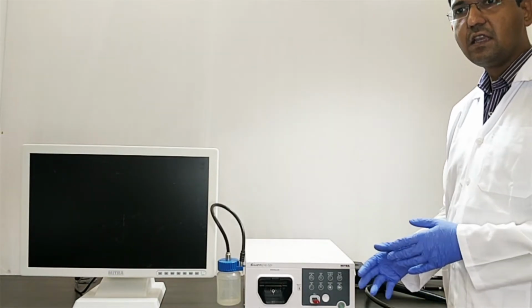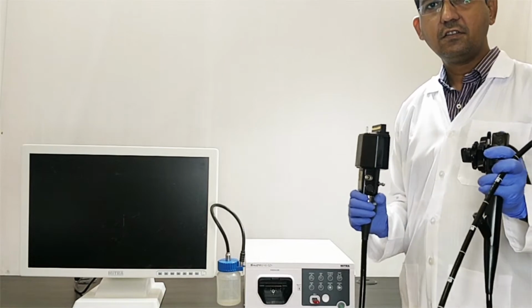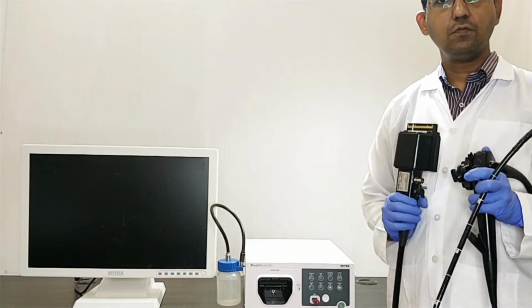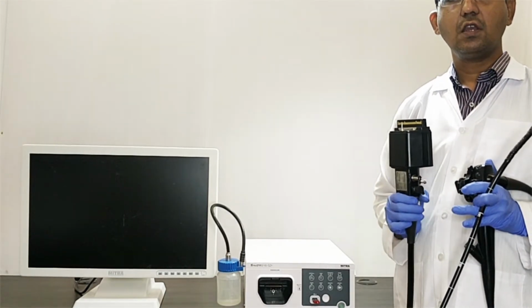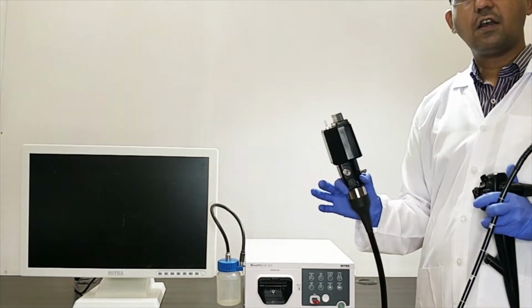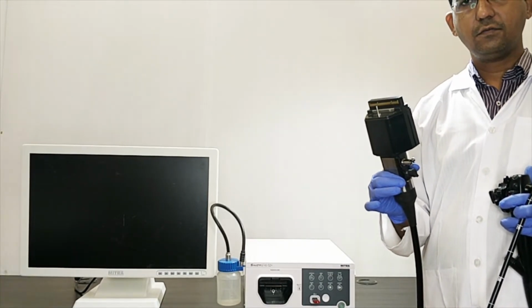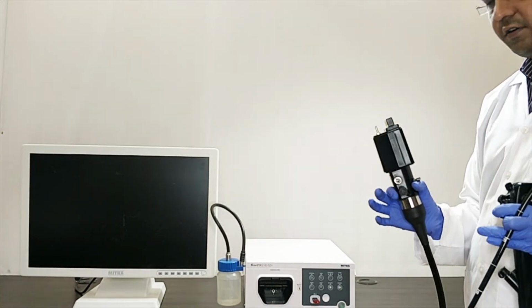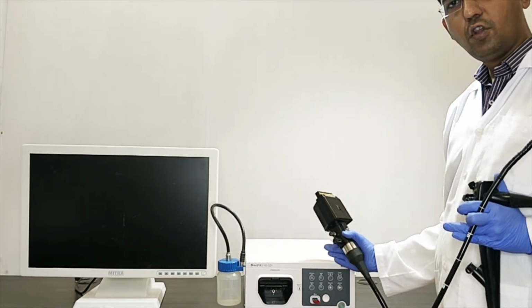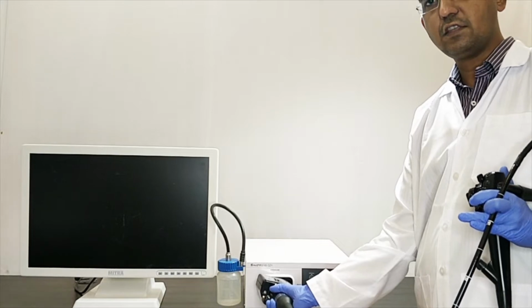Next we see how to connect a video gastroscope. I am connecting this Ottomed video gastroscope. The model number is OVG S2 Plus. This is an ultra light waterproof connector. This is a single step connector. I am connecting this to the video processor. The video processor model number is OVP S2 Plus.